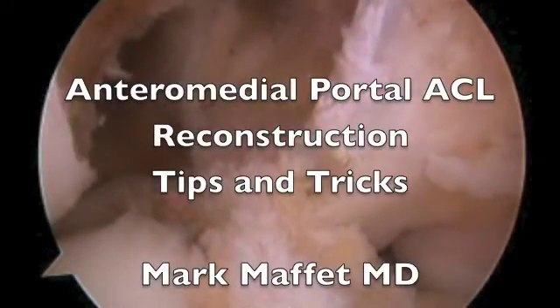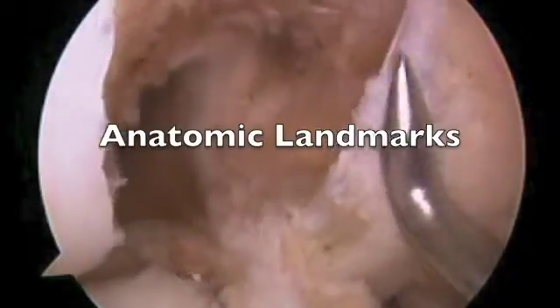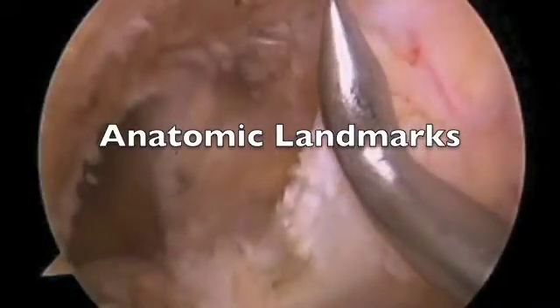I have put together this video to summarize my experience with anterior medial portal ACL reconstruction. First, I want to go over the landmarks.